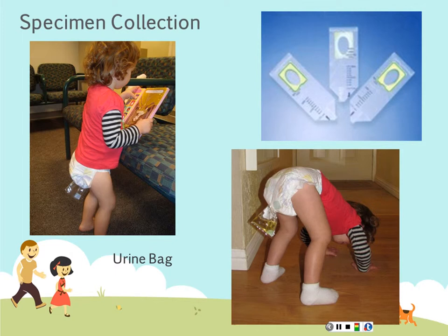Now, if you could get a male infant prepped well with your betadine or CHG, whatever they have you prep it with, and get it stuck on really well, you might be able to obtain a pretty sterile specimen collection with a urine bag. Other than that, you're not going to be able to. So traditionally with a urine bag, you're only going to use that with a urinalysis.